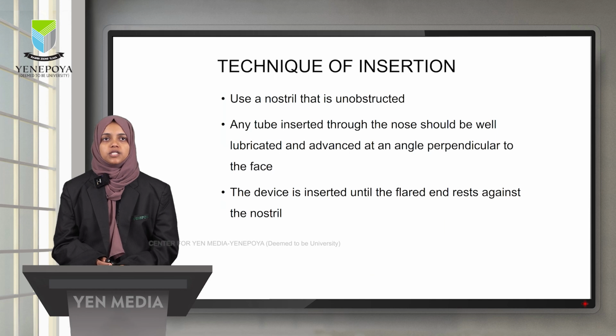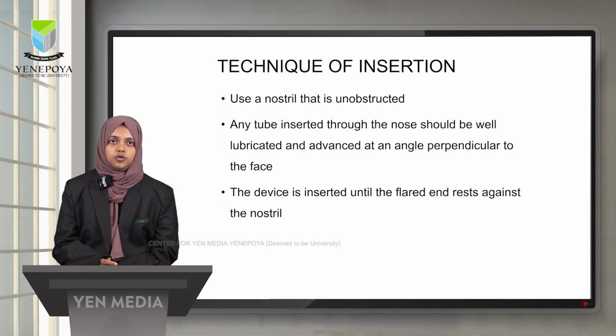Now the technique of insertion of a nasal airway is to use a nostril that is unobstructed. Any tube inserted through the nose should be well lubricated and advanced at an angle perpendicular to the face. The device is inserted until the flared end rests against the nostril.